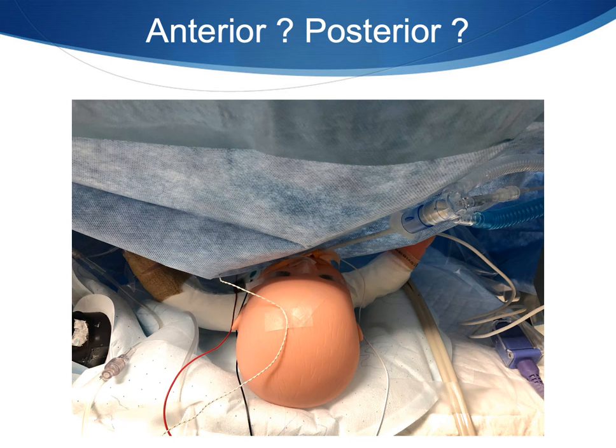You've got big halogen lights having heat coming from the anterior side. All this heat is great to keep them warm, because our pediatric population we want to keep warm, but what does it do to that endotracheal tube? It makes that endotracheal tube very soft and pliable. You have a soft, pliable endotracheal tube connected to a heavy circuit.